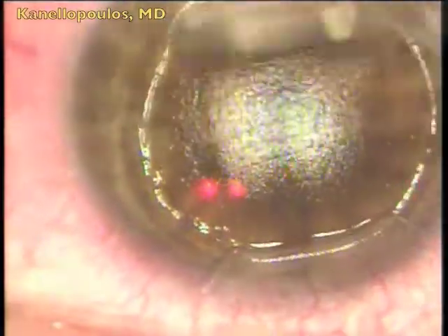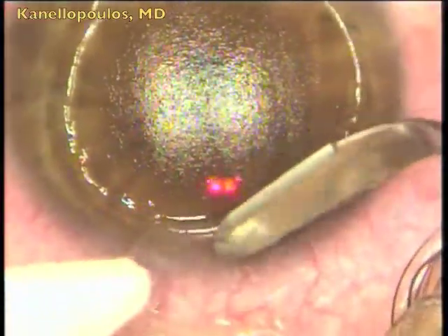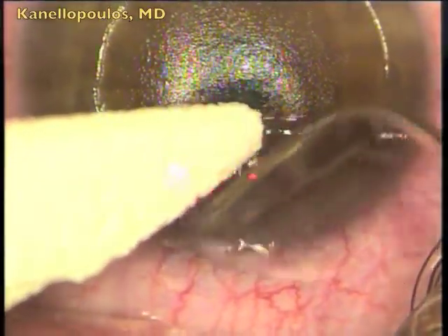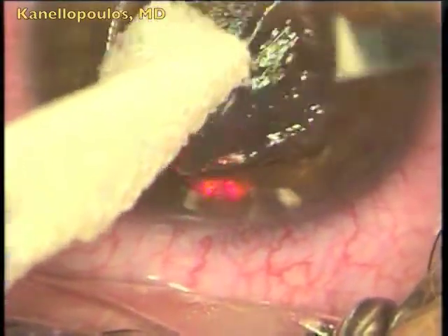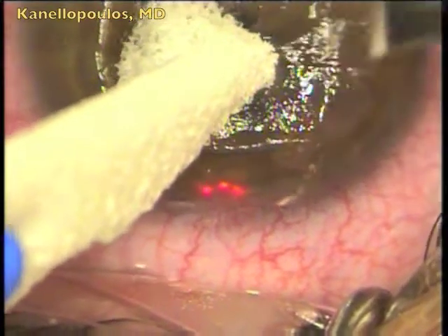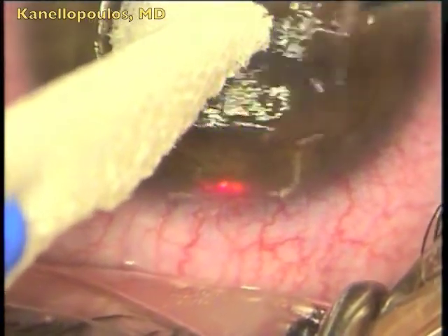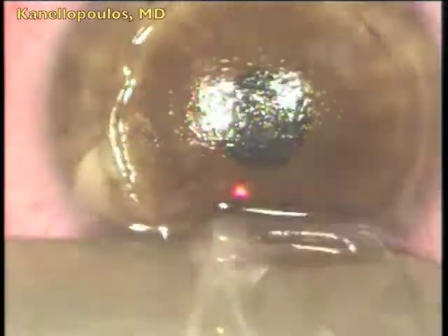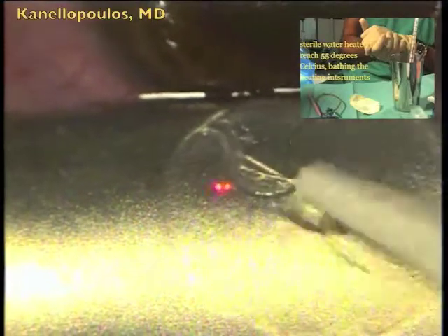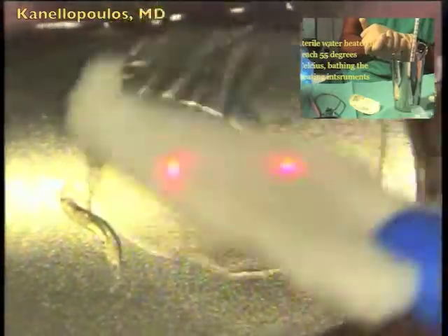The instruments are preheated in sterile water — and I'm underlining this — sterile water, so this is extremely hypotonic, at 55 degrees Celsius. Very carefully on the underside of the flap with the Crescent, I'm trying to remove this very large band. I'm very careful because, as you saw on the OCT, the flap thickness is extremely thin. Here I am laying my flap on a preheated instrument, and with a dry wick, I'm very successful in stripping off this band of epithelium that was underneath the flap, creating that humongous crease.